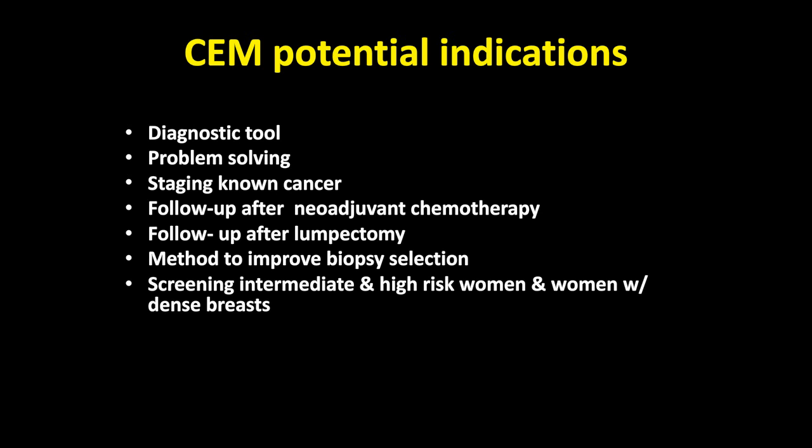One of the things we've suggested to our genetic doctors is that when you're doing women with mutations, since they're getting yearly MRI, to use contrast mammo as the alternating exam when you're doing every 6-month studies, and we've actually begun to do that.